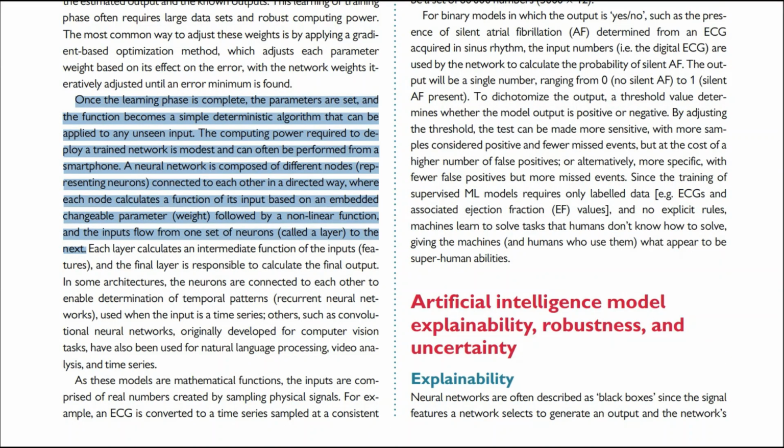Once the learning phase is complete, the parameters are set, and the function becomes a simple deterministic algorithm that can be applied to any unseen input. The computing power required to deploy a trained network is modest and can often be performed from a smartphone.